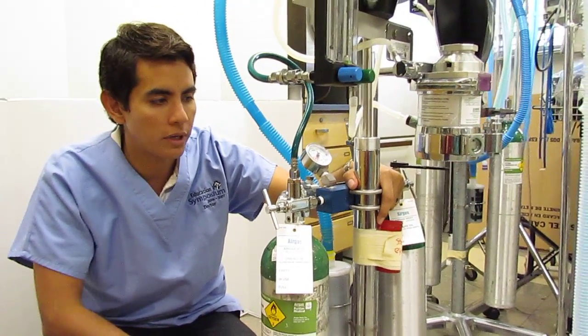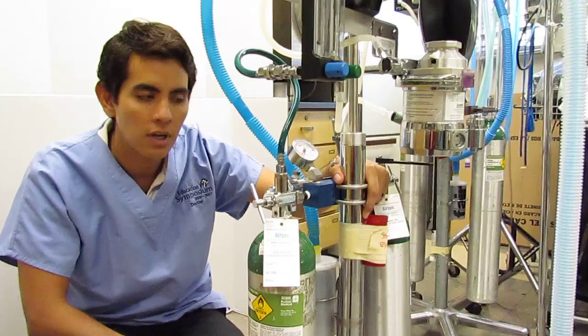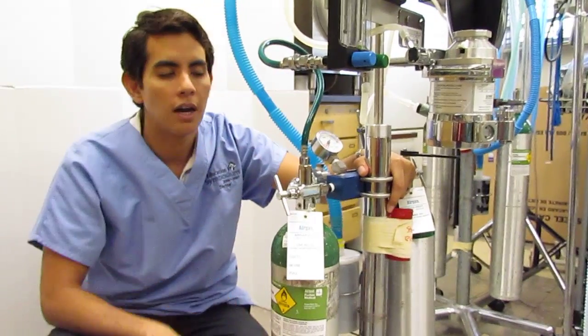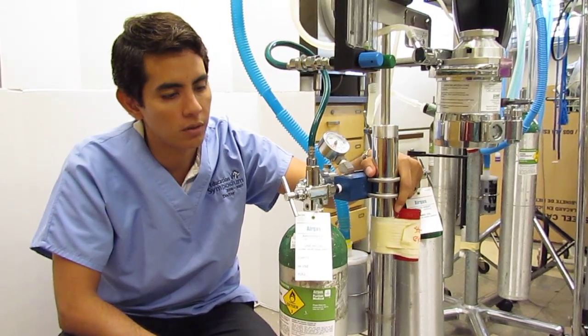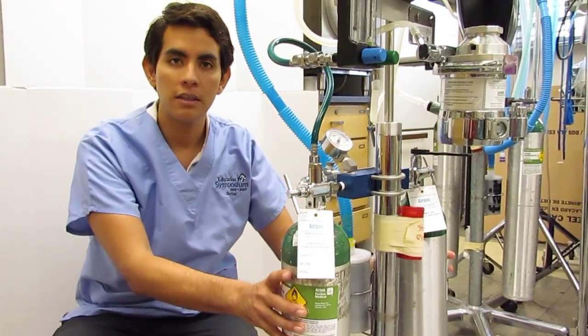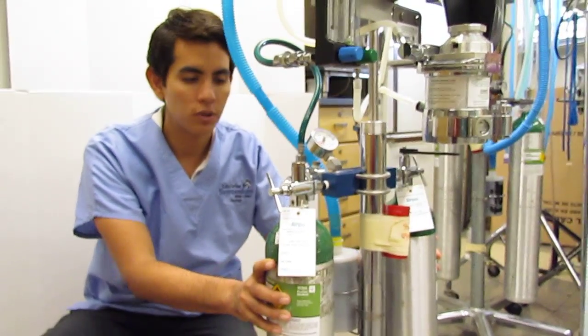So when you do that, what I recommend is that you go ahead and start with a source of oxygen and then follow the oxygen through identifying every single component on the way. In this case, we have E tanks. E is for emergency, and these are portable tanks.